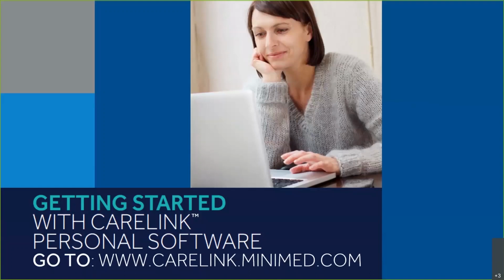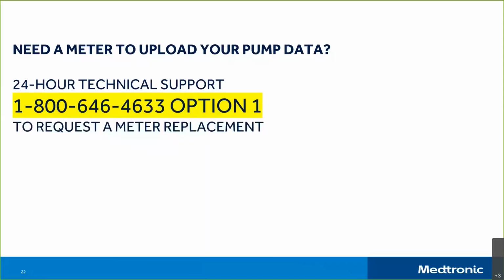So since we went through a lot of information very quickly, I wanted to reference a few key points for you. So first, in order to upload your pump, you'll want to go to the CareLink personal software website. The website again is www.carelink.minimed.com. Second, if you're needing a meter to upload your pump, you can request a replacement meter from the 24-hour technical support line, 1-800-646-4633, option 1, to request this replacement.